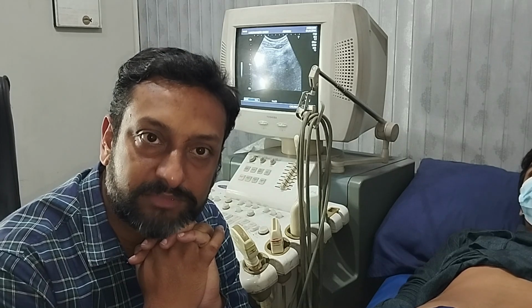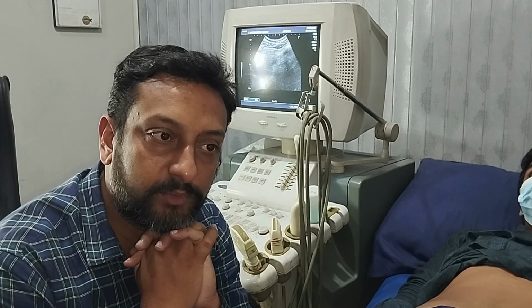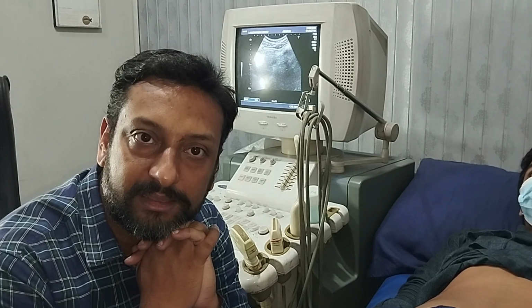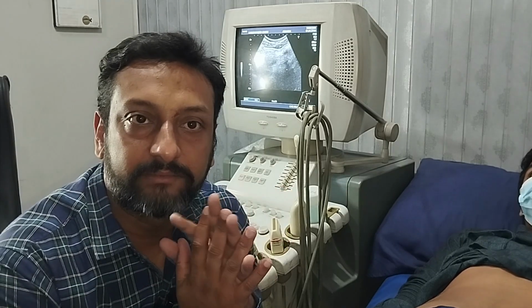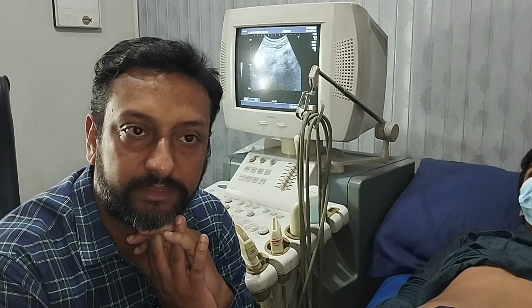So in those cases, it becomes difficult to visualize the pancreas. Now, what conditions are we supposed to see in the pancreas? The pancreas is a homogeneous structure. If it is heterogeneous in texture or it has fluid around it, it means that the patient is suffering from some disease, likely acute pancreatitis.